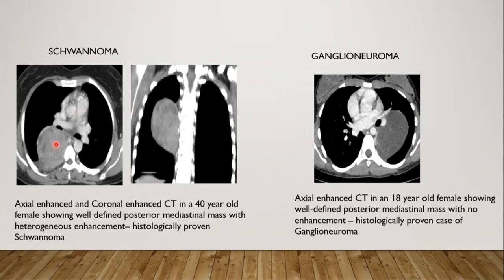Schwannomas are the most common nerve sheath tumors. On contrast-enhanced CT, they appear as heterogeneously enhancing lesions in the paraspinal region. The heterogeneous enhancement is because of the cystic and hemorrhagic areas within. Ganglioneuroma is more common in children older than 10 years, and on contrast-enhanced CT, we can see an elongated lesion in the posterior mediastinum with only slight to moderate enhancement.